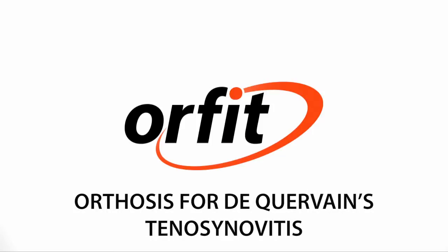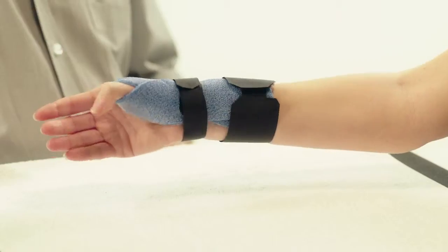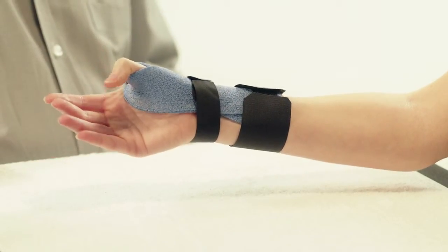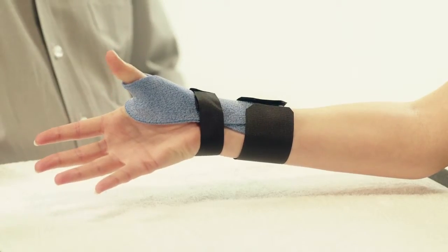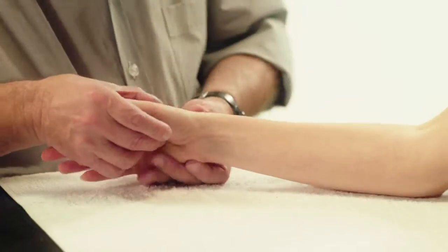Orthosis for De Quervain's Tenosynovitis. Here we will demonstrate how to fabricate a radial gutter immobilization orthosis for patients with a diagnosis of De Quervain's Tenosynovitis.